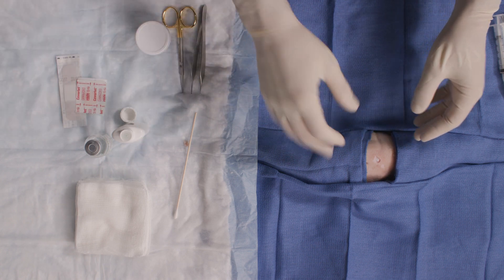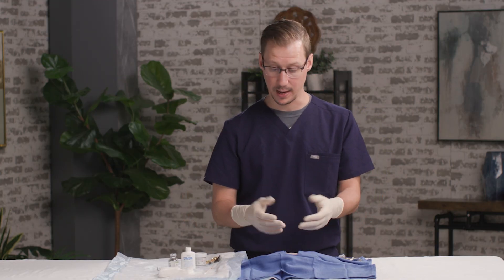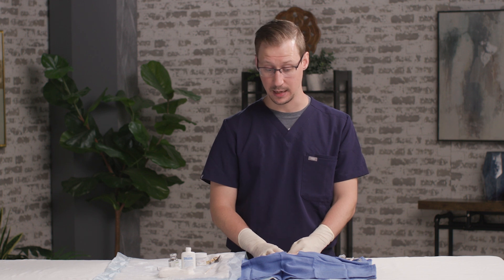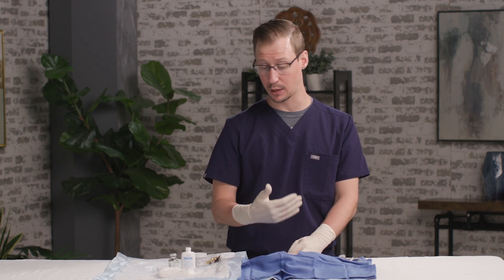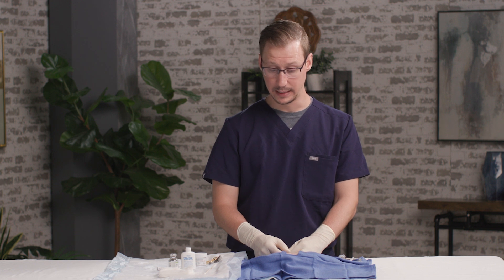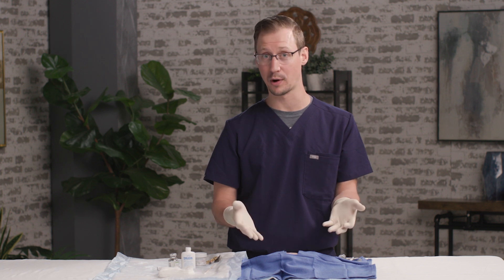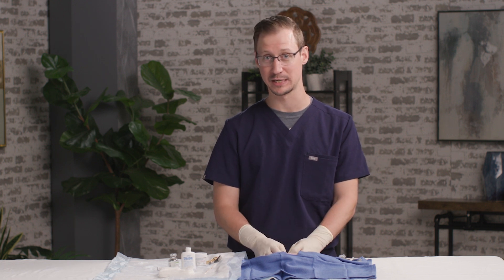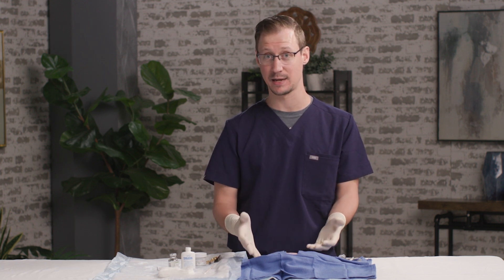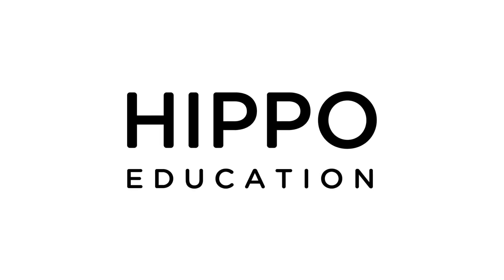Last but not least, I can apply a couple of band-aids just over those sites. Tell the patient to leave it on for about 12 to 24 hours, then they can remove the band-aid and apply some petrolatum once or twice a day. These sites will heal pretty quickly by secondary intention — sort of like a nasty razor burn. The patient will be really grateful because you took care of their bothersome skin tags, and they'll be more apt to come back and see you for further derm procedures. That is skin tag snip excision. Thank you. This is Hippo Education.